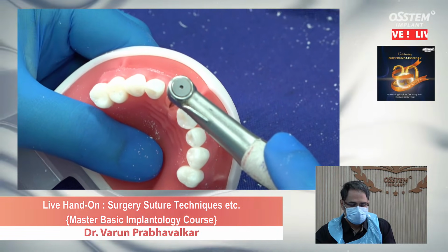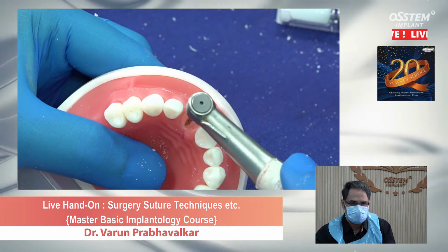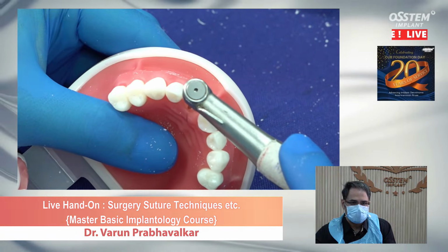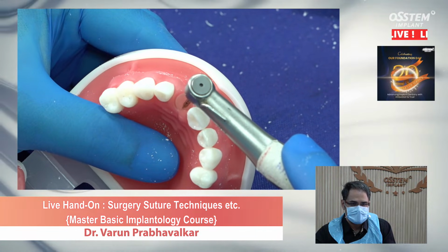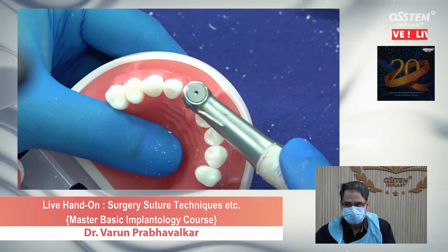Angulation which you can create over there can be corrected also prosthetically up to 20 degrees. So that depends on the housing, and I would ask the enthusiasts to please read the Joseph Kan classification of the socket.